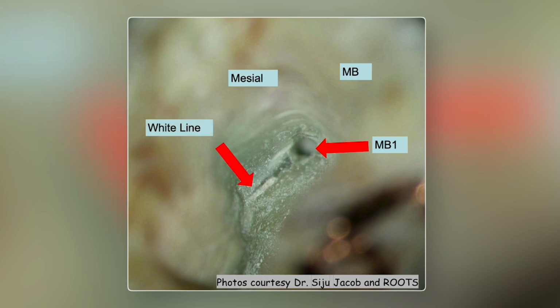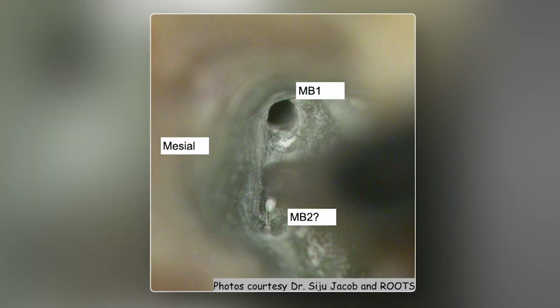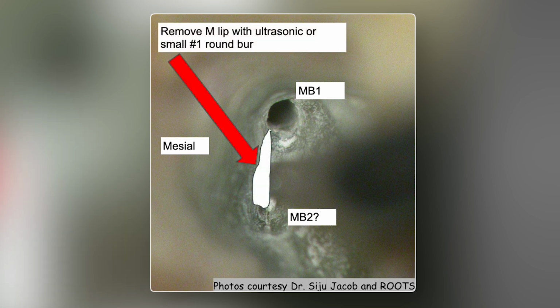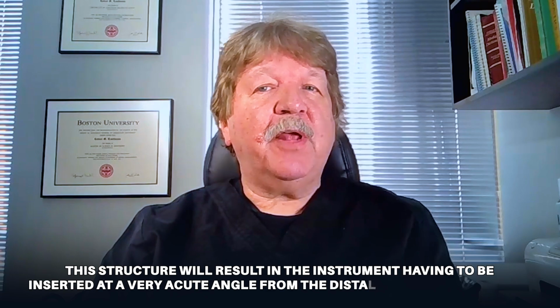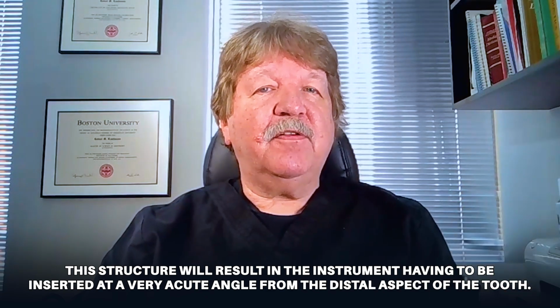Once MB1 is located, higher levels of magnification are used to trace the groove running from MB1, usually in a palatal and mesial direction. MB2 is usually located under a dentin lip that projects from the mesial side of the pulp chamber. This lip has to be removed in order for us to expose the orifice and allow the file to be inserted. If you don't remove this lip, the instrument has to be inserted at a very acute angle from the distal aspect of the tooth.